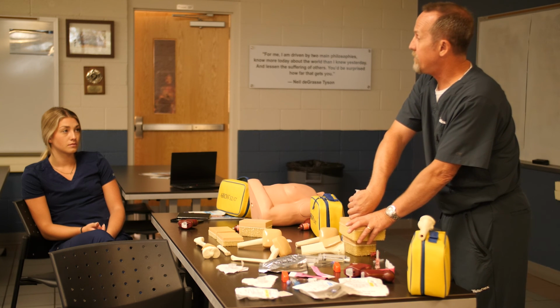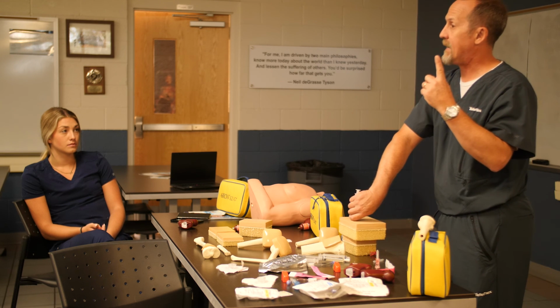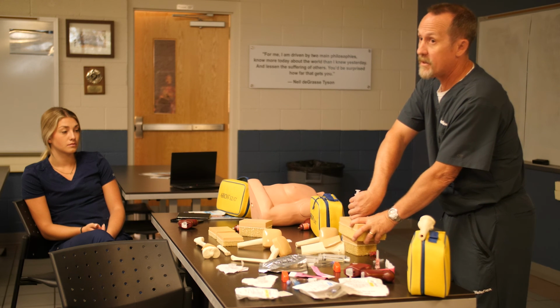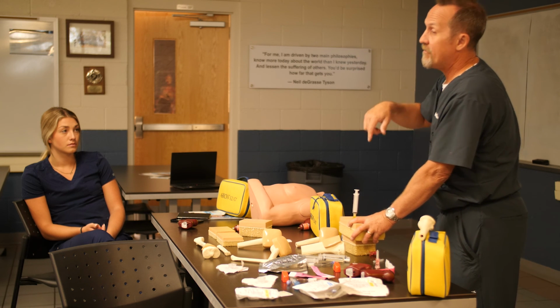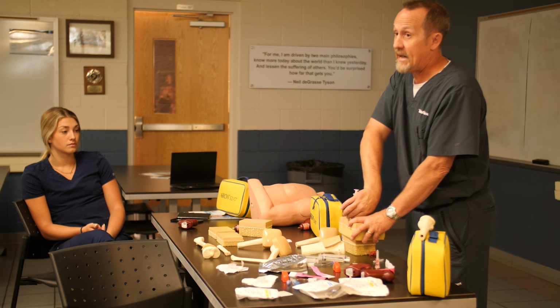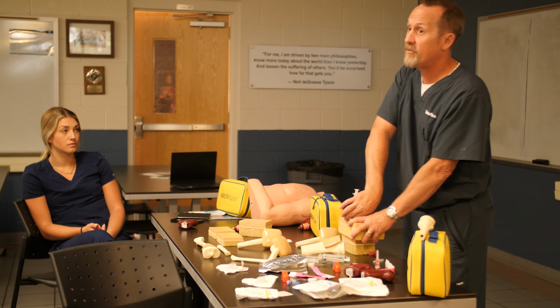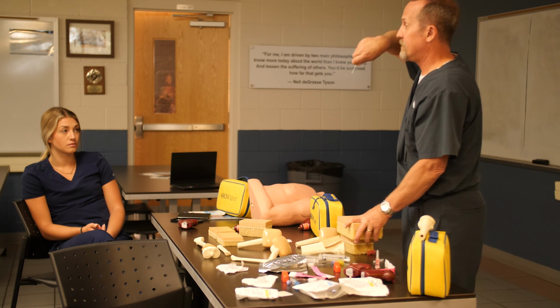There have been instances where people have broken the hub off of the catheter and now you've got a piece of metal sticking out of the bone. We have to get a surgeon to retrieve it. It's a mess. So do not rock back and forth. What we want to do is put counter pressure on the patient and pull straight up and out, okay? If it's ever really bound up and you're trying to get it out and it doesn't feel like it's coming, the catheter still has a little bit of those cutting teeth on it. You can actually 10 and 2 a little bit. It's okay to twist it back and forth from the hub just to free it up, but we just want to pull straight up and out.